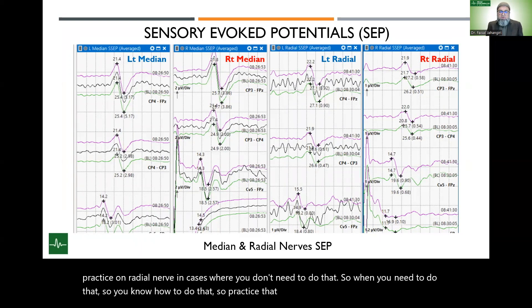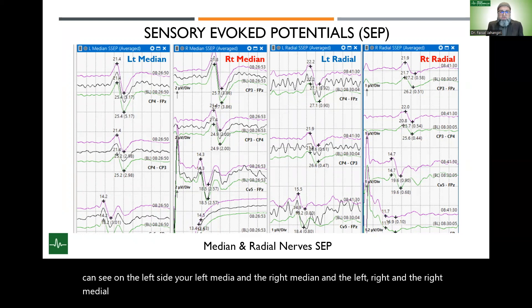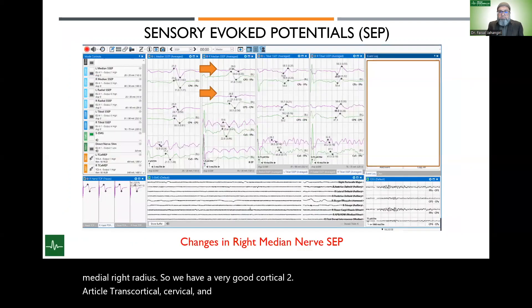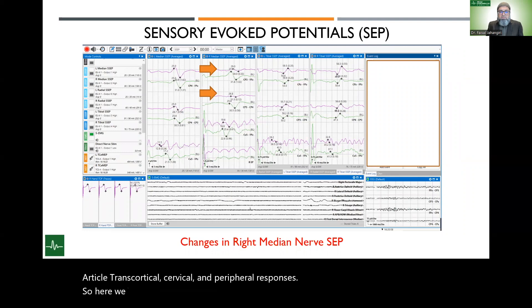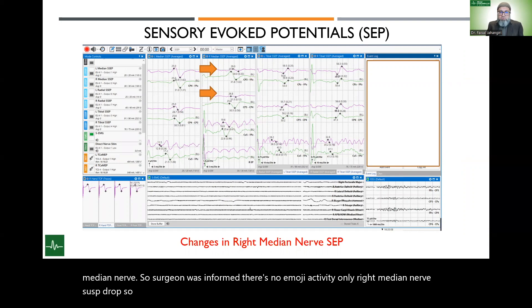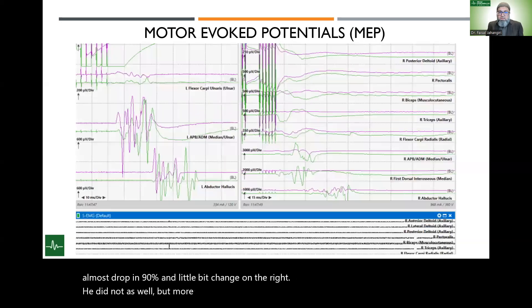On the picture, we can see left median, right median, left radial, and right radial SSEPs with good cortical, transcortical, cervical, and peripheral responses. In one case, there was a change in the right median nerve SSEP with no EMG activity. The surgeon was informed, removed the traction, repositioned the arm, and the signal came back. In another case, the right radial nerve SSEP dropped almost 90%, with a lesser change in the right median nerve. The more significant change was in the radial SSEP, and these changes were reversed.